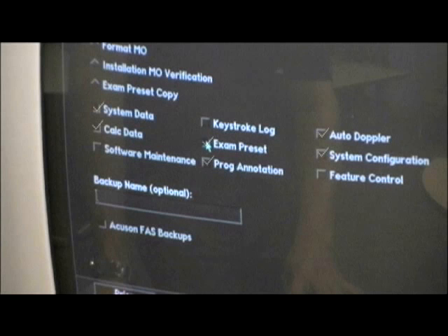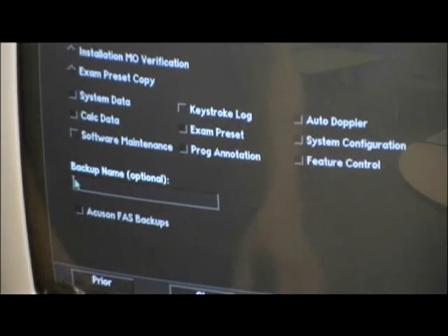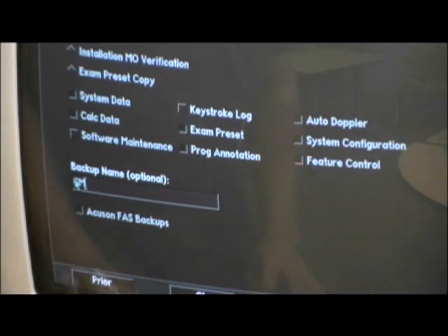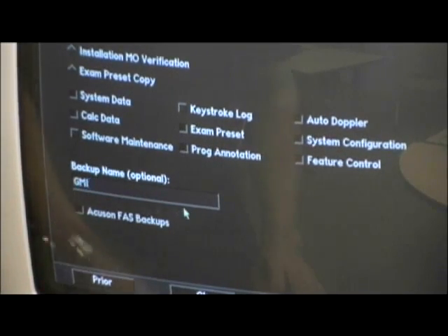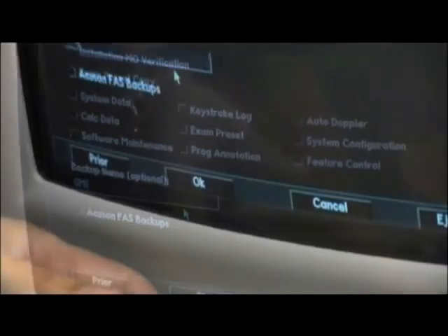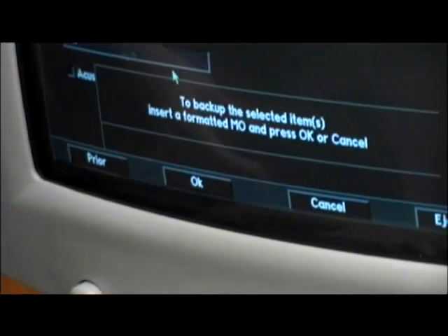And Feature Control. Once these are clicked, a backup name should be assigned in the backup name field below your file selections. After a name is assigned, click OK.